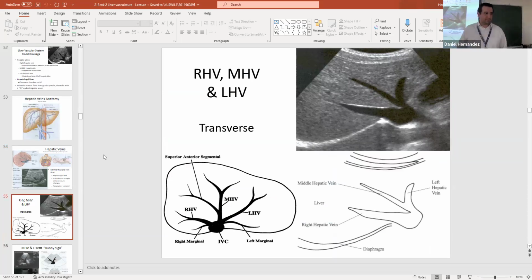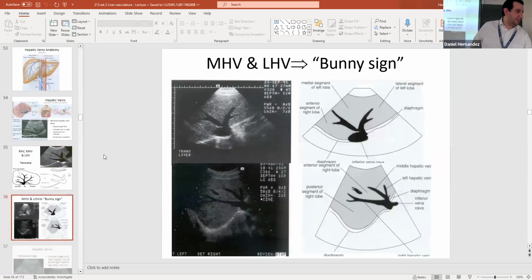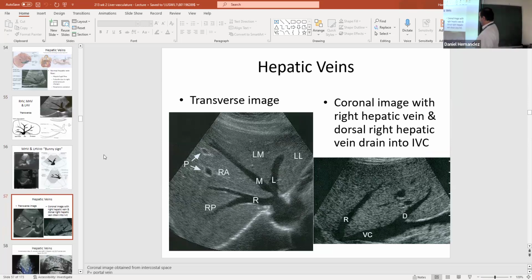So the one we Doppler is the middle one. Well, this is a transverse view, so in sagittal, it looks a little bit different. So here's your side, this is kind of what you guys are seeing, and the heart's up here. We're flipped the other way. Because the probe is the opposite. Echo does this, everything's flipped, so they look at it upside down. Not upside down, I guess you guys are more true. The heart's on the bottom right. Left is, well, our right, the right of the screen, and now it's on the left.